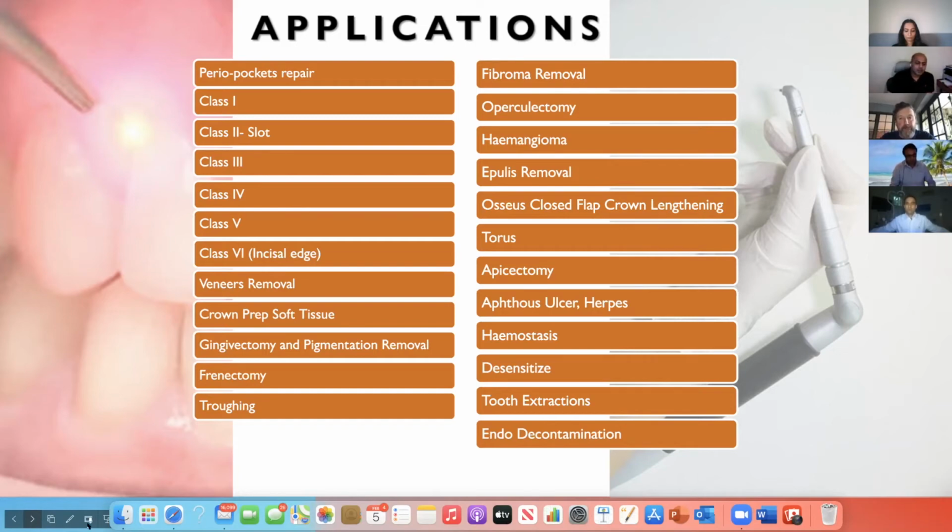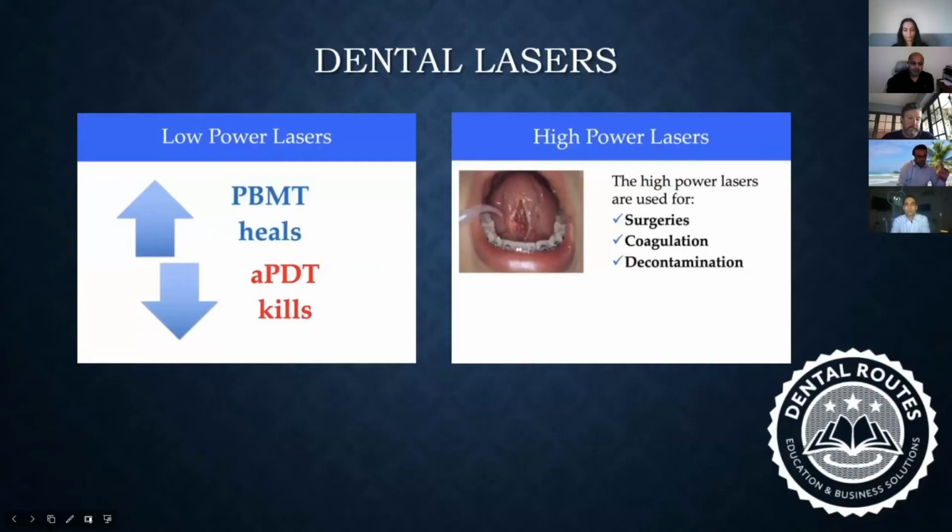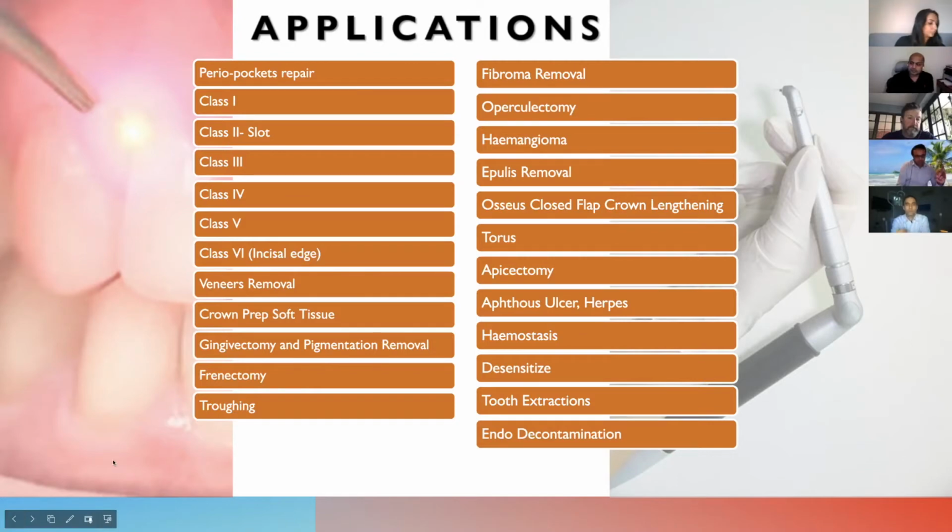Okay, so as we go forward in our next sessions, we can go into each of these and see how we can use dental lasers to maximize the quality of care that we can provide to our patients. Sorry, Kaushik, just to go a slide back, can you explain? I'm quite curious to know about this veneer removal or crown removal. What is that all about?